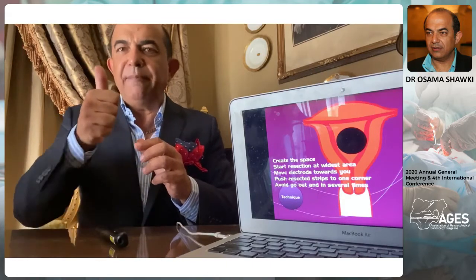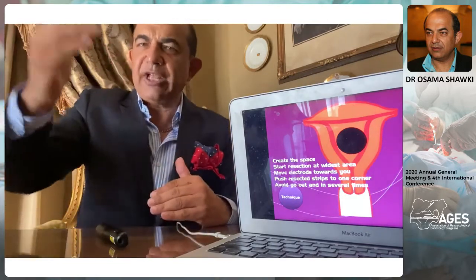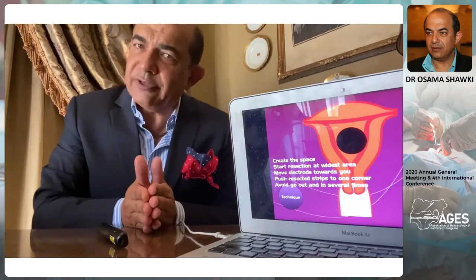Number one, and the most important, the duration of the procedure. The longer the duration, the higher the chance of fluid overload. Number two, the volume of fluid. Don't tell me that I'm working with a low pressure and you consumed 11 bottles of fluid. Oh, this is absolutely ridiculous.